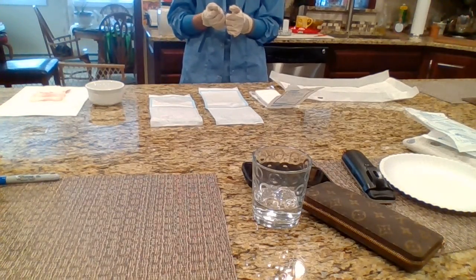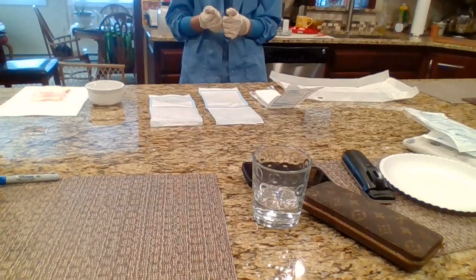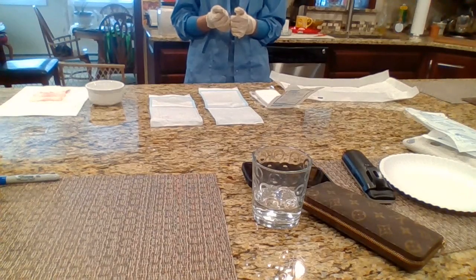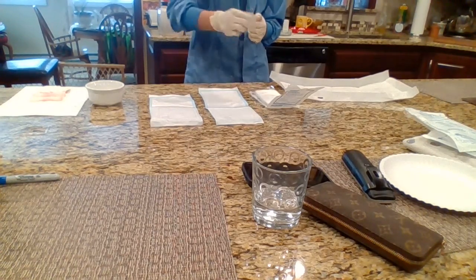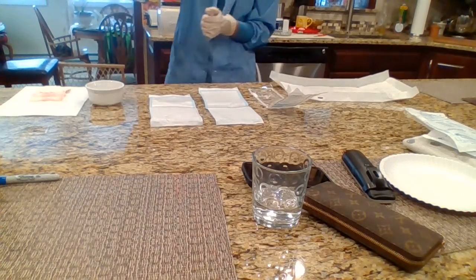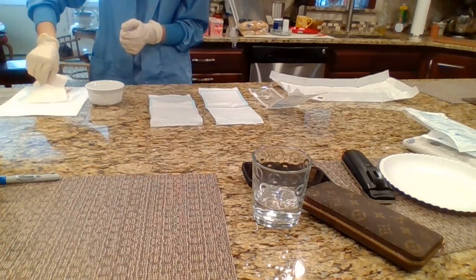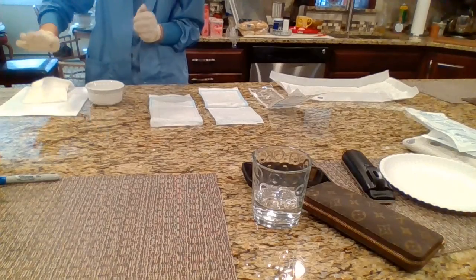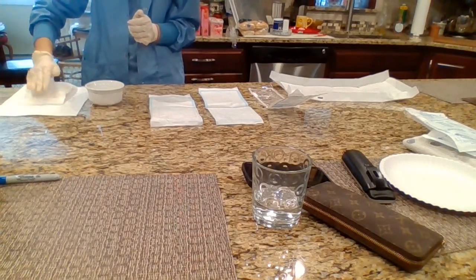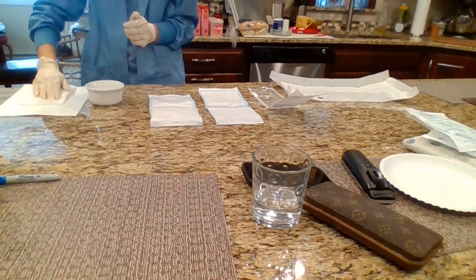Okay, so the gauze is applied, it's covering the whole wound. So after that, I'm going to apply my ABD pad. The way I do that is just by pinching it, then I just do a little shake to unfold it, and then I'm going to place it down over top of the wound. The sterile part is now complete, so I'm going to just press down, flatten out the ABD pad.